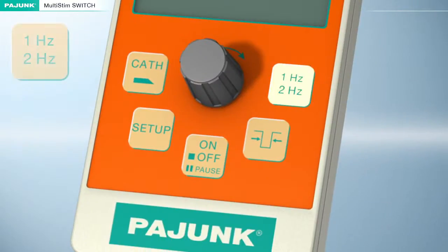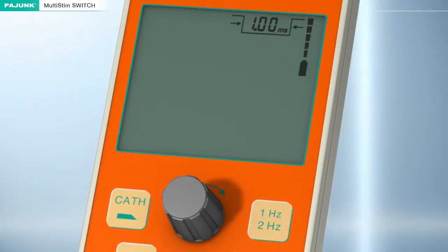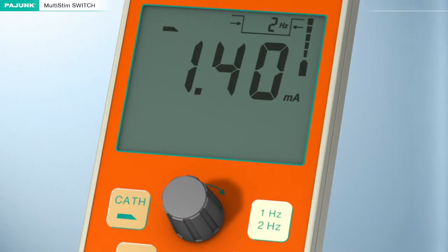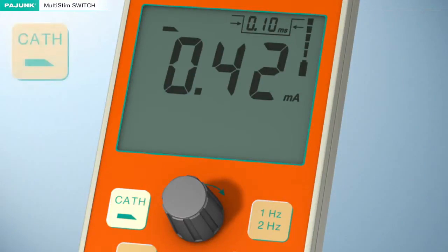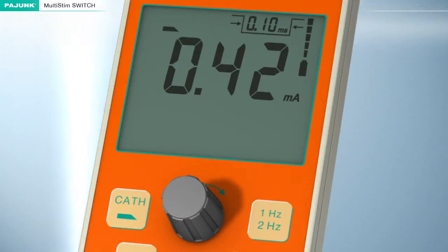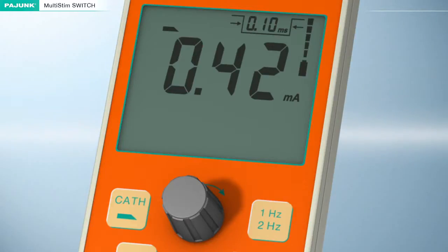Pulse Repetition Frequency. The desired pulse repetition frequency can be selected with this button: one hertz or two hertz. Output channel. The Multi-Stim Switch provides two alternative options for stimulation: via a cannula or through a stimulating catheter.